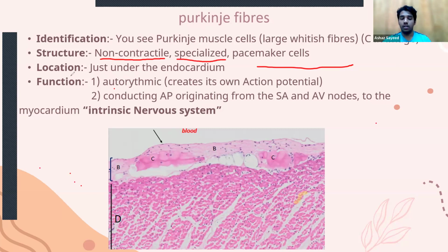And the location is just under the endocardium. More specifically, just under the endothelium. It's part of the endocardium, but it's just under the endothelium. This might sound a bit confusing, but I'm sorry, I didn't put it right. It's just under the endothelium and it's in the endocardium.